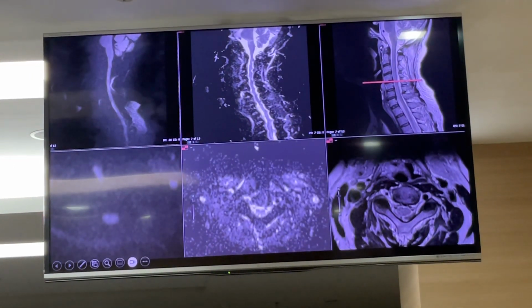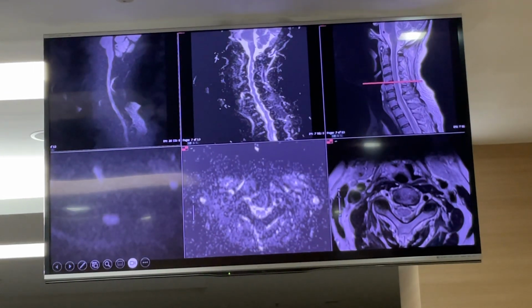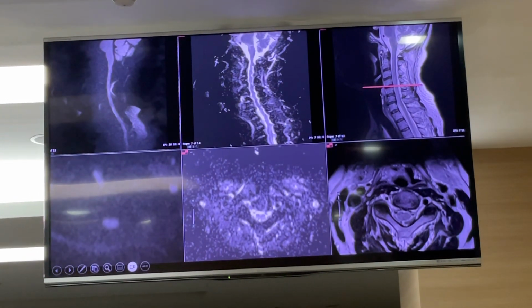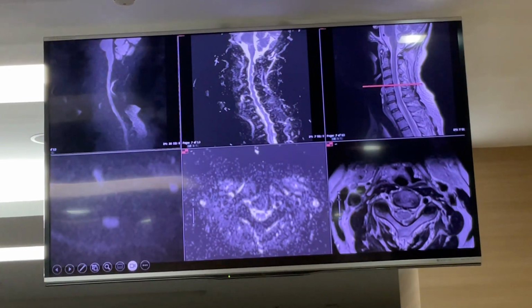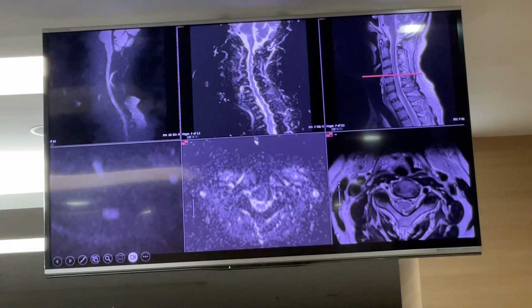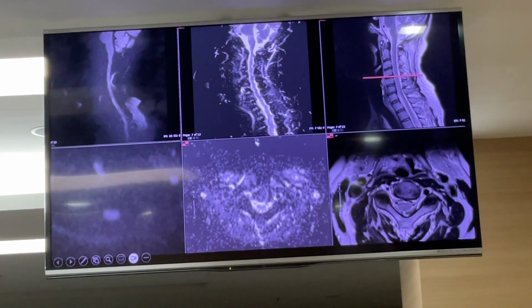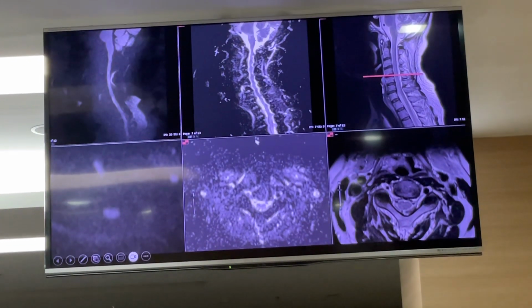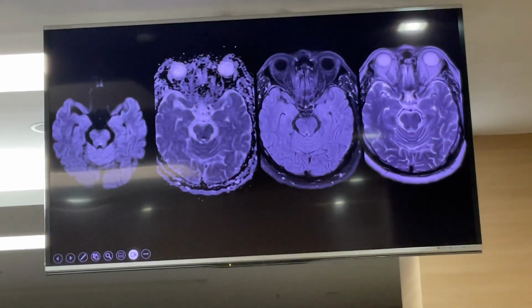You can compare. This is normal. Okay. These things have to be set up on site at the MRI, right? Because you cannot think about setting up this thing properly without preparing, because the patient is on the scanner. Yeah. Okay. You have to prepare this.